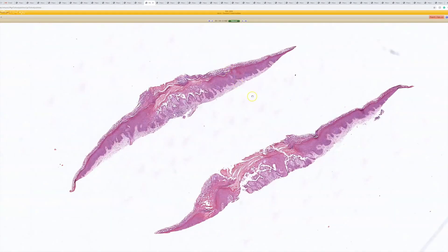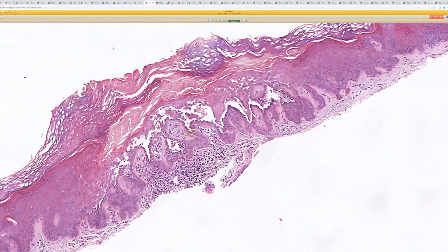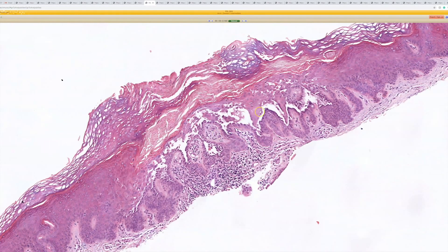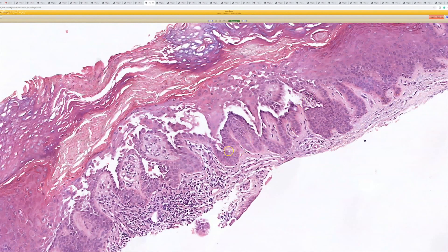Alright, next one, case 12. From low power there's acanthosis, hyperkeratosis, and there's kind of like a little papule in the middle. You can see intraepidermal acantholysis and it kind of has these papillary fronds projecting from the basal layer into the space.